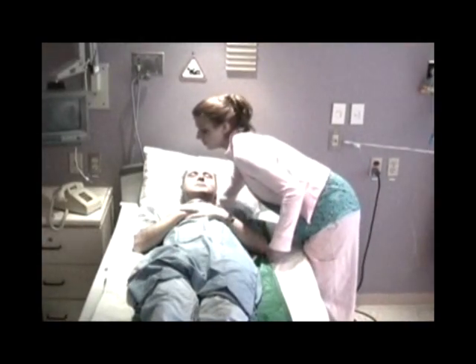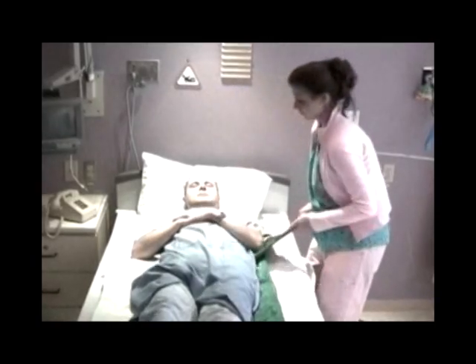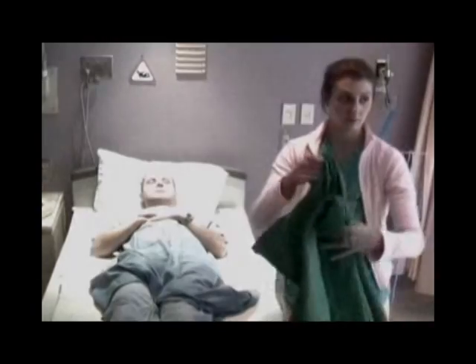Do not attempt to move beyond caregiver's base of support. Remove the slide sheet from under the patient, if used, by grasping the corner at the patient's farthest shoulder, turning the slide sheet under itself as you pull in the direction of the patient's hips.